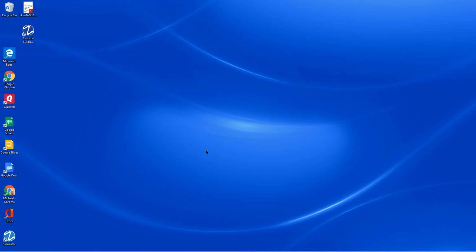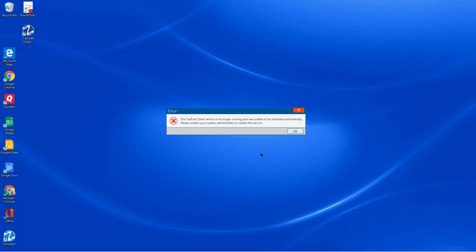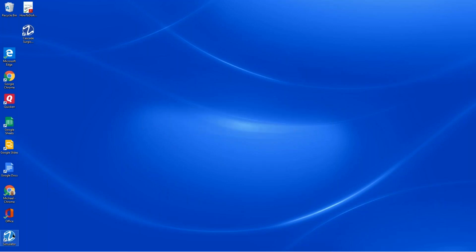And Mike, we noticed Studio does take a few more seconds to launch than the Classic. I think we found out because it's a pretty intuitive program, it has so much to open up that's involved in Surgical Studio. And that's what makes our life easier through this program. Exactly.